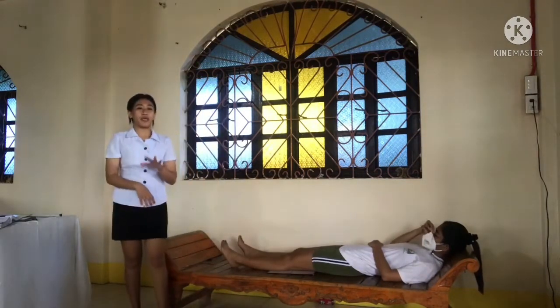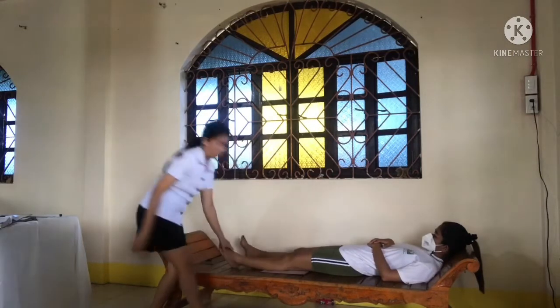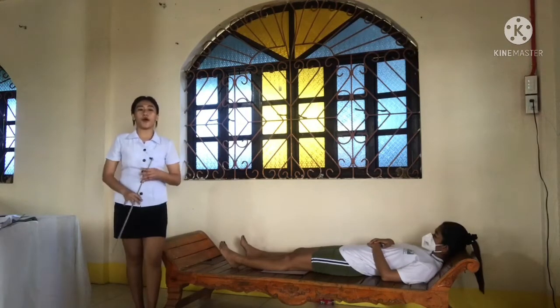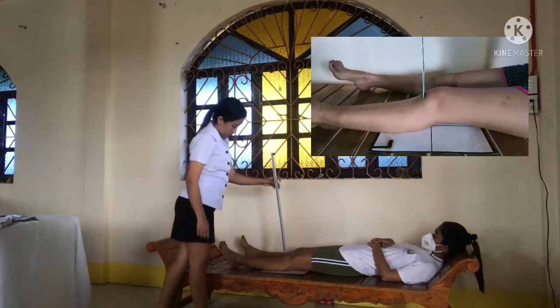So with the IR under the patient's knee, flex the joint slightly, locate the apex of the patella, and as the patient extends the knee, center the IR about 1/2 inch below the patellar apex. This will center the IR to the joint space. So the central ray for this projection is directed to a point 1/2 inch inferior to the patellar apex. So this shows an AP projection of the knee structures.